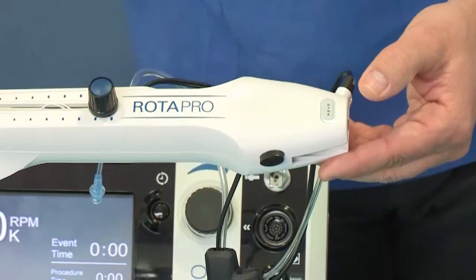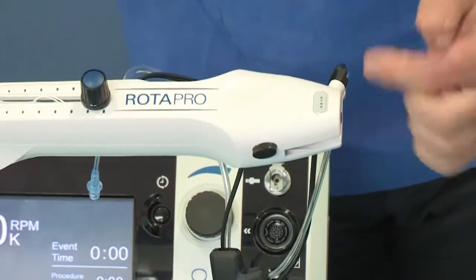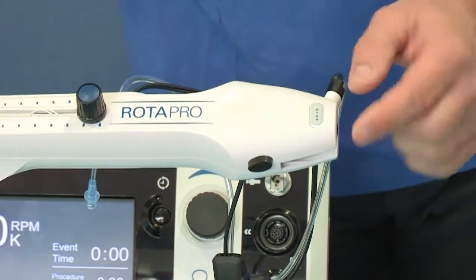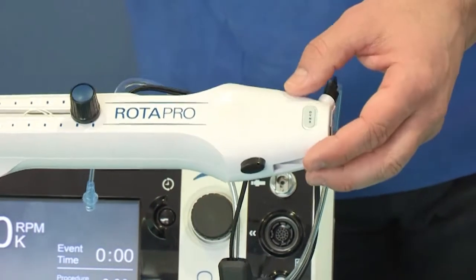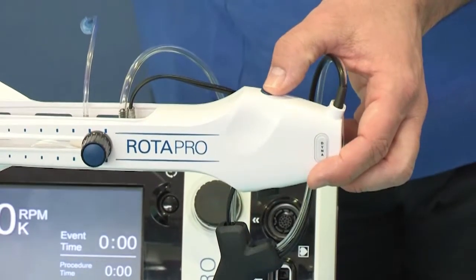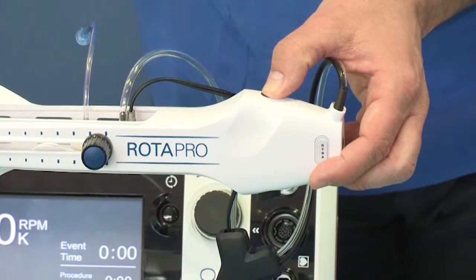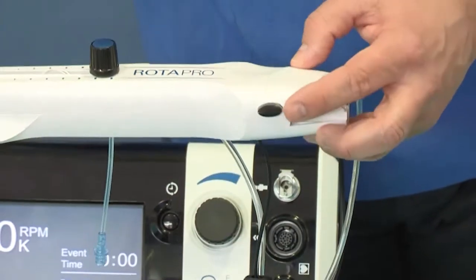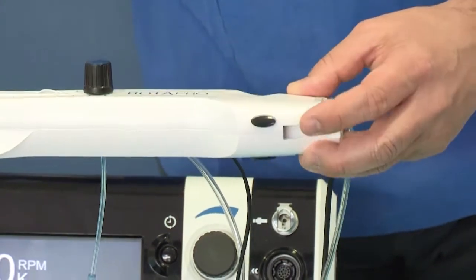Let's move now to the Dynaglide mode. We click on this button. We are now ready to activate the motion of the rotor in Dynaglide mode, but we won't do this by pushing on this button again. We have now a new button on this side of the advancer that is used, when pushed, only to activate the Dynaglide mode. On the opposite side, we also have this button here, which is used to release the brake.